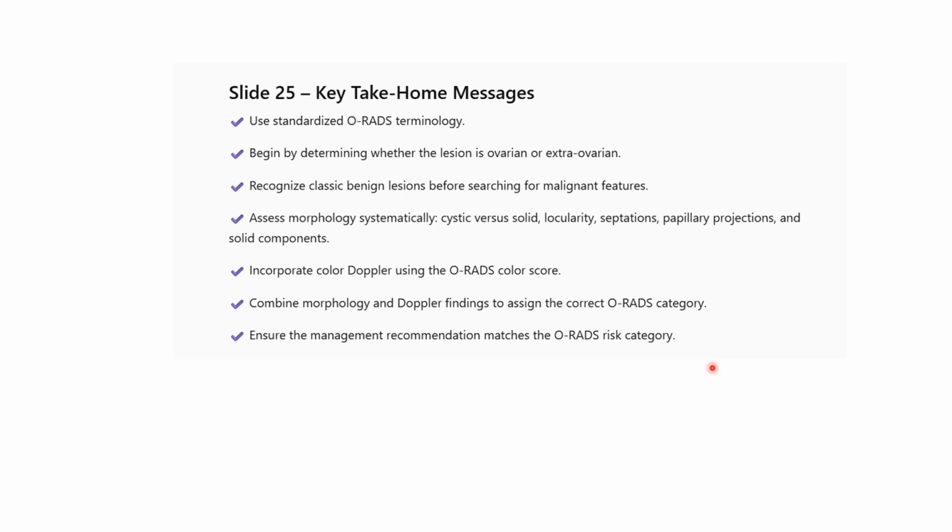So this is the Bible. This is what you have got to follow, guys, when you are classifying ovarian masses using the O-RADS classification. This is very fundamental and key. Also when you're doing the reporting, your report must be standardized, in America, in Romania, in Sudan, wherever. If you use the same language, we resonate well and we understand each other. So let us not use vague wording when we are doing the reporting.